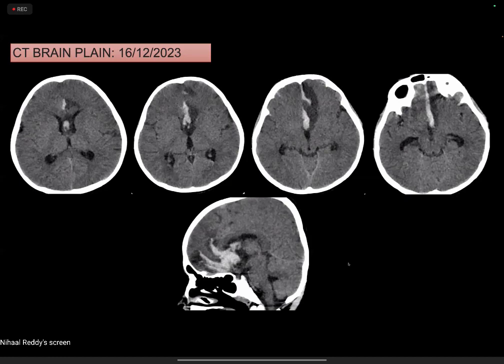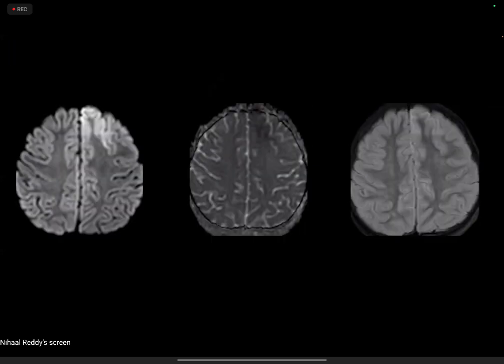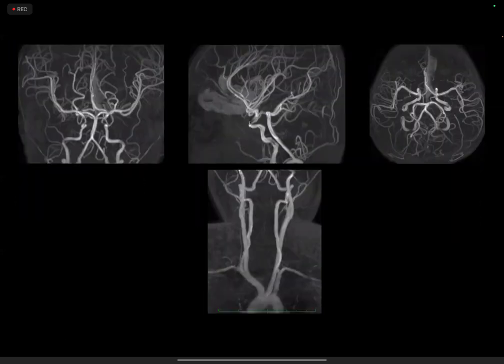Should we do any further imaging to look at that? I mean, if you can provide us the MRI sagittal of this, it is something. Okay, I'll try to send it. Was it not commented on, I guess? No, there was no comment on the pituitary stalk. I just looked at the bright spot, whether it is there because of the DI, but I thought that it is there. If you see, at least now it is. If you see the outline of the hematoma, it is in the region of the suprasellar sellar. Yeah.